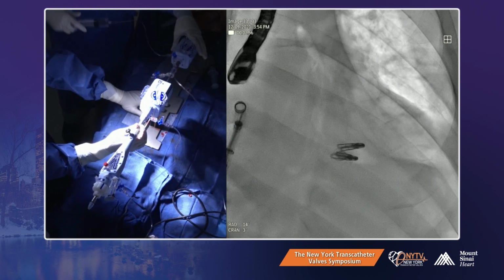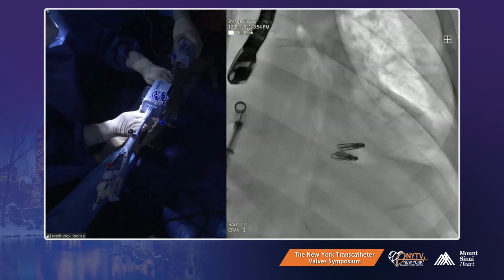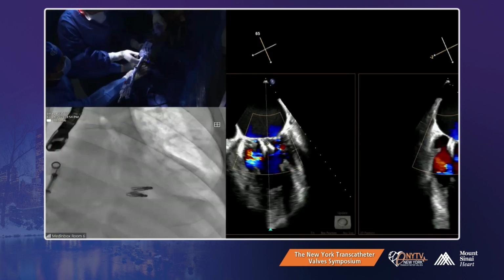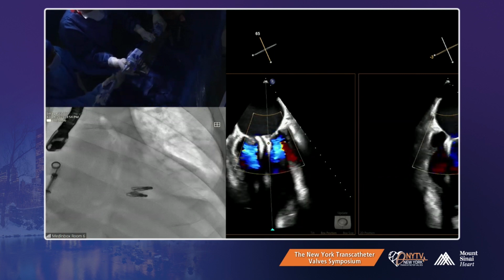No, it's okay. At the end of the day, you got a good result. Let's see the final heart rate, the final echo, and I'd also like to see the left atrial pressure waveform. We have to show them the tracing, right?